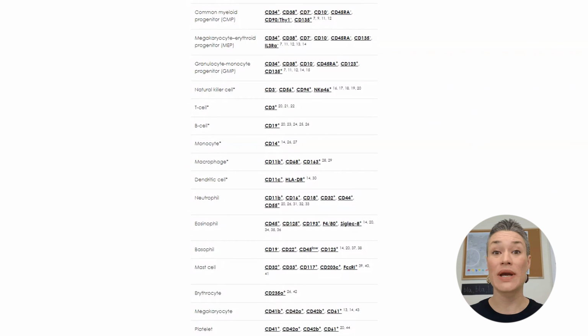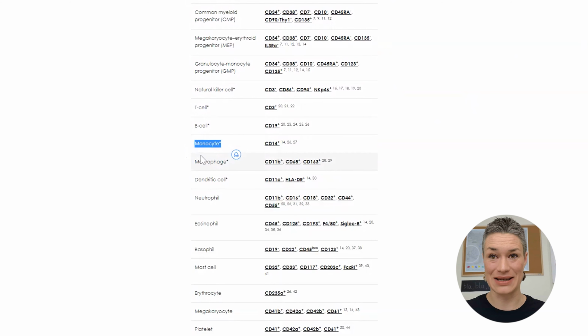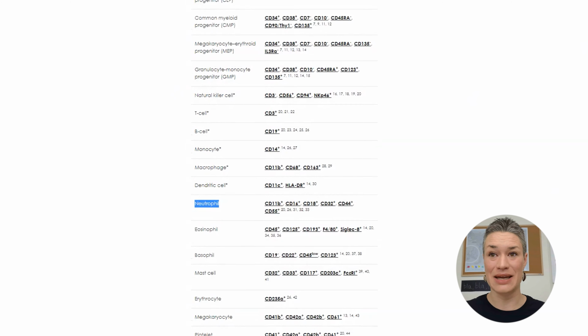And immune cells can be visualized in tissue, which is fantastic because if we can visualize it in tissue, then we can do image analysis and quantify them. How can we visualize those cells? We can see them on H&E, but there we cannot distinguish different populations. And there are so many different populations. Let me just show you a couple of them. Natural killer cells, T cells, B cells, monocytes, macrophages, dendritic cells, neutrophils, and many, many others.